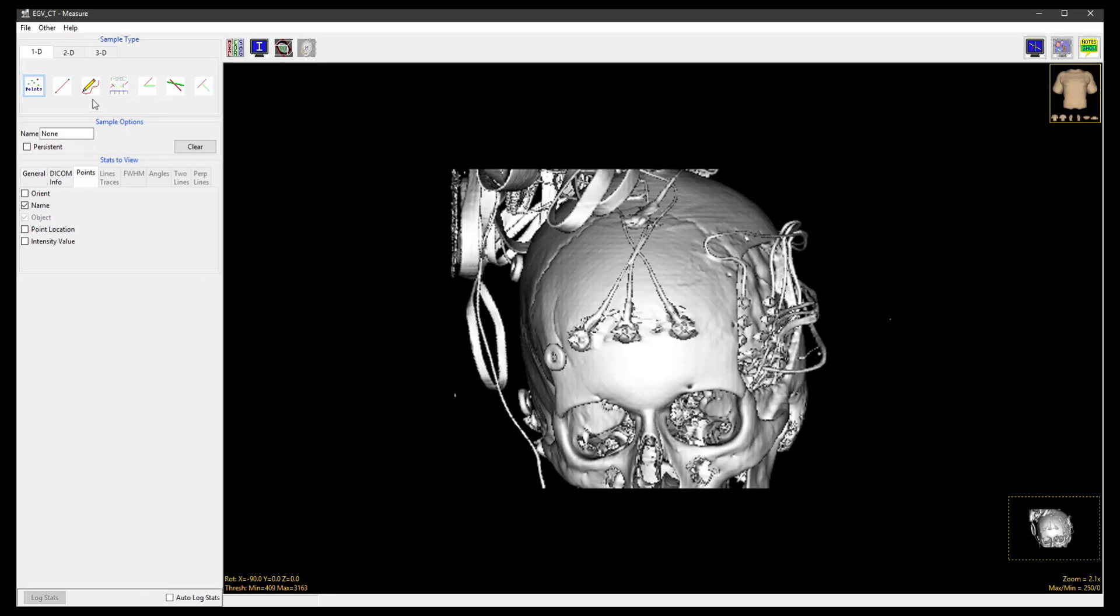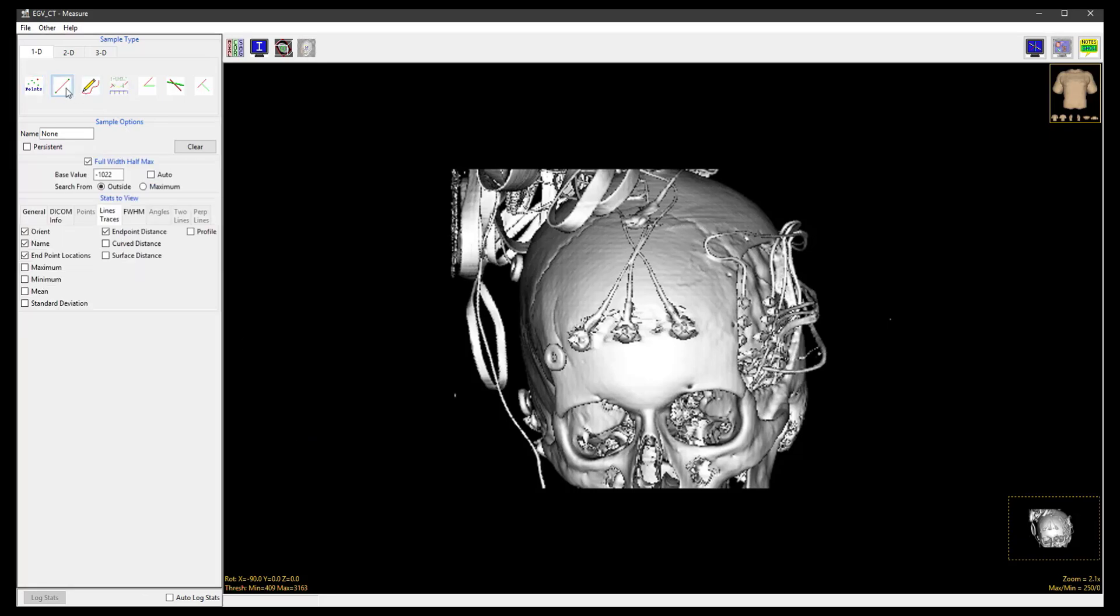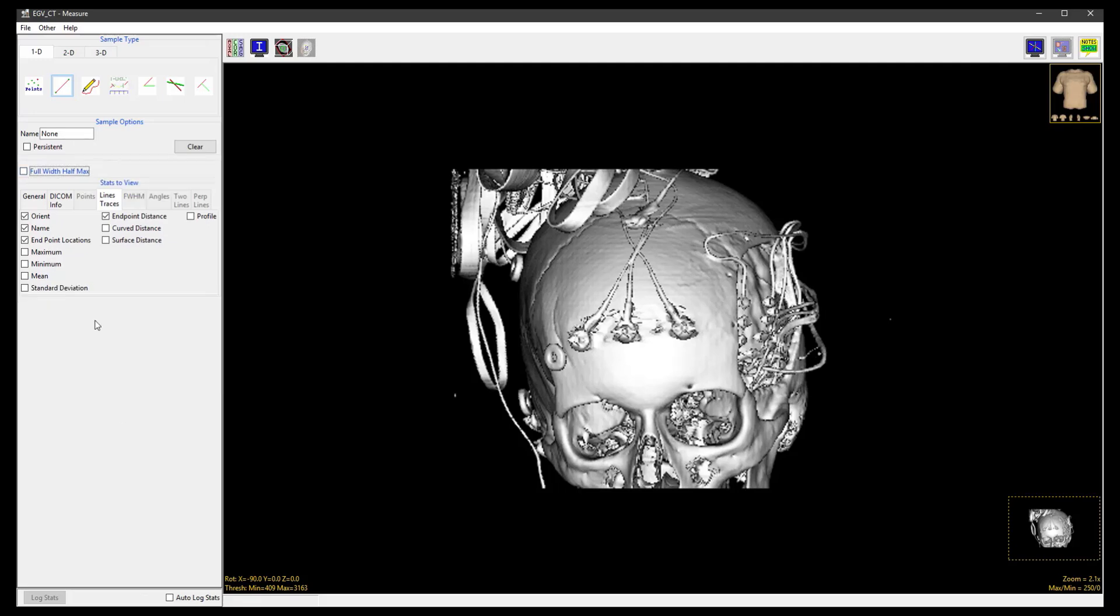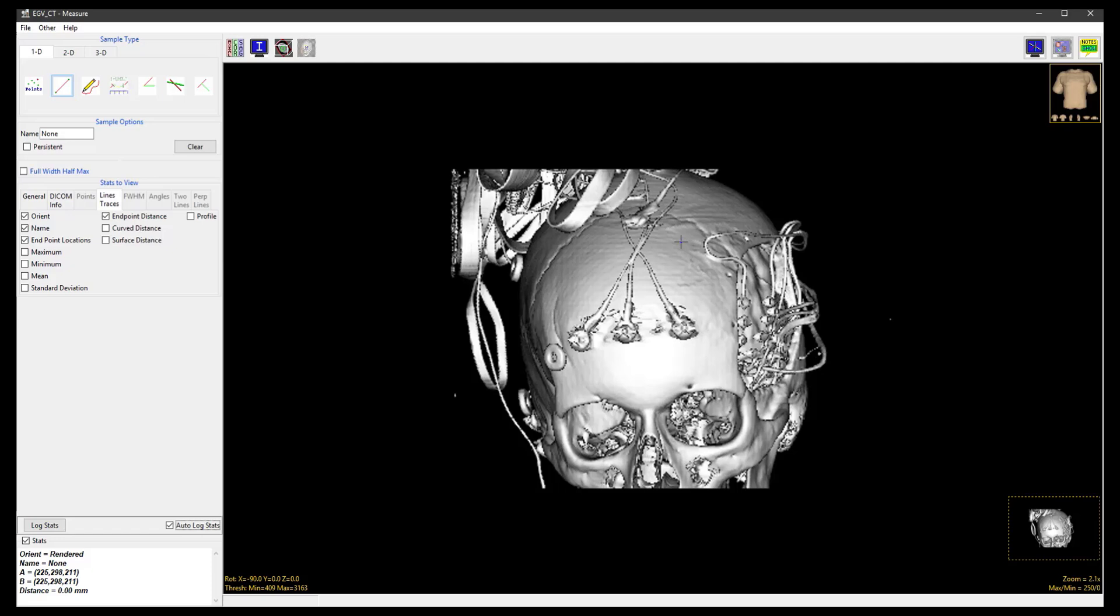From the 1D Sample type, select the Sample Lines tool. Check Auto Log Stats and trace a line on the skull by clicking on the start point and dragging to the end point.